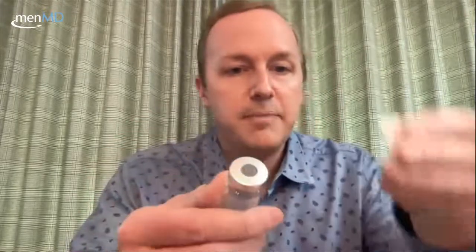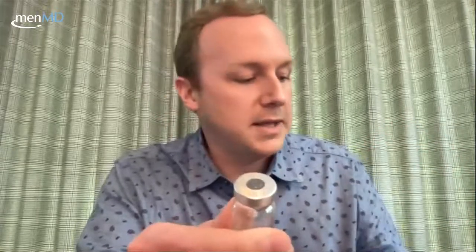I have a prop penis that I'm going to use, and this always gets a little strange because I have to hold on to it. If you're doing the injection yourself, obviously you'll have both hands free, but because I'm going to be showing you how to do the injection with the prop penis, I'll be holding on to it. First things first: I'm going to open an alcohol prep pad and rub the rubber stopper on top of the vial to clean it — just a couple of vertical strokes. Let that dry for a moment.